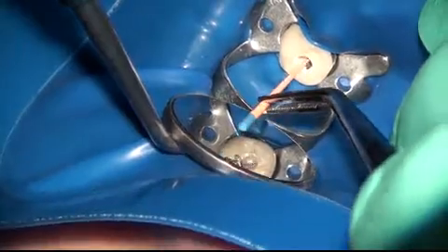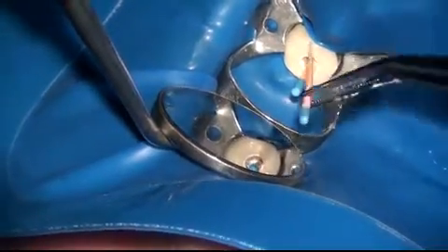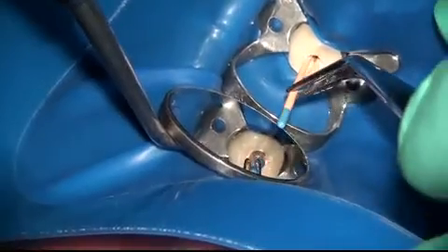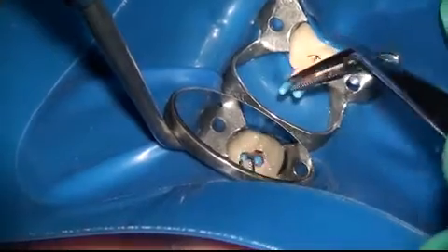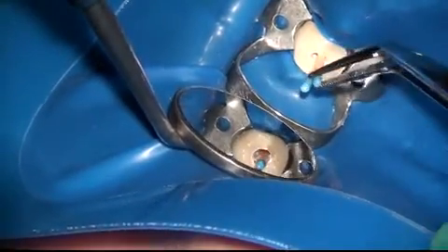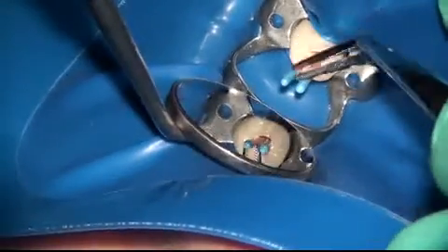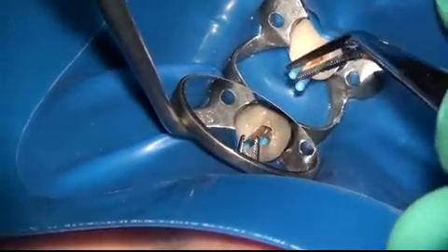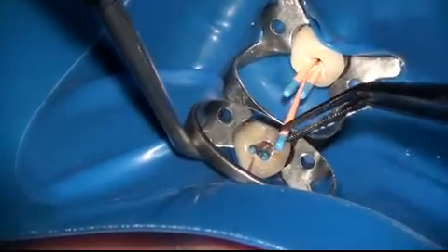Once the sealer has been applied, the three EndoSequence gutta-percha cones that correspond to the EndoSequence rotary files are cemented into place. It's very important at this point to visualize the orientation of each canal deep inside the tooth, so that you can place your cones and slide each one into that particular canal.